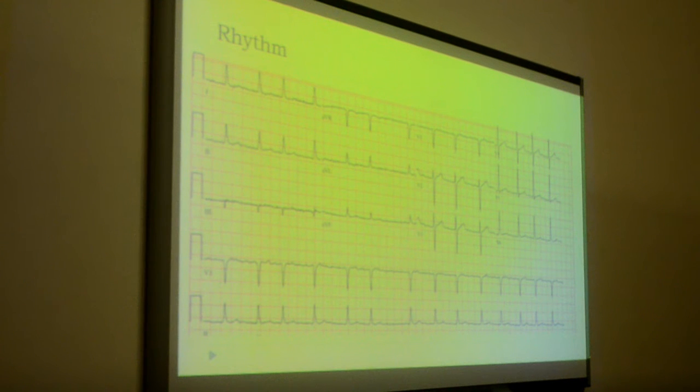You can clearly measure the pattern. You can say, okay, I know there's going to be 3 normal beats, then a skip beat. This is regularly irregular. But what you're most likely to get is an irregularly irregular rhythm. There's no pattern. Here there's almost 3, this one's 4, this one's 5.5. There's no pattern. This is what we call irregularly irregular.